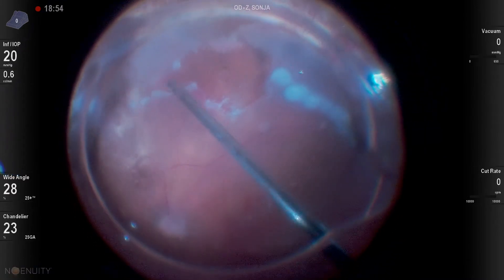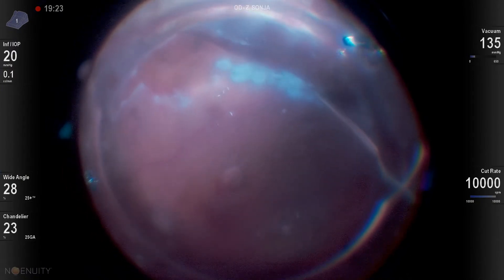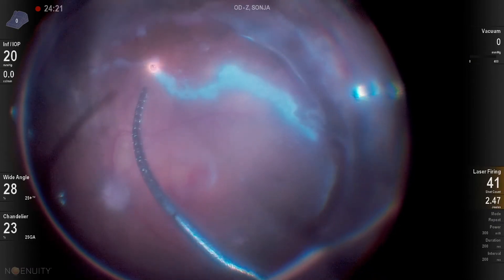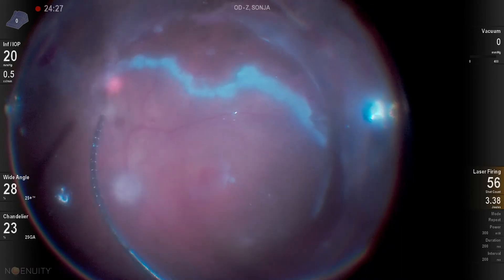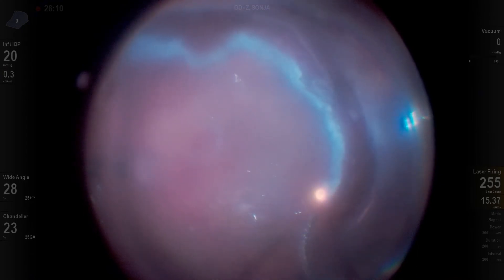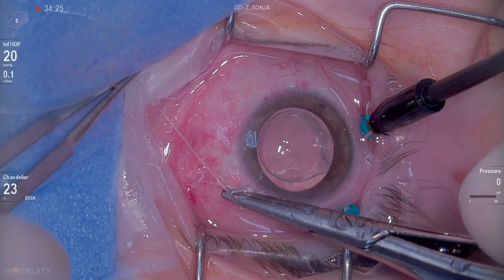You can see I'm retinectomizing over to an area where there was a scar. We're able to retinectomize and laser along those areas. I do have to make a couple of linear retinectomies anteriorly to clear out detached retina and get that retina flat and lasered up. But I'm able to get her completely reattached under oil with a retinal transplant.